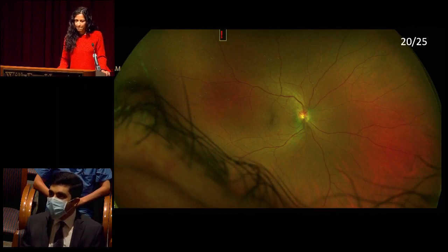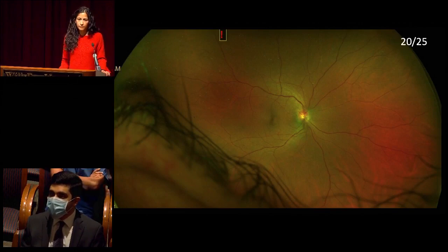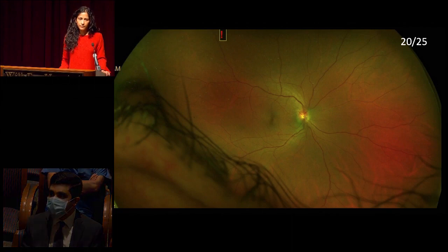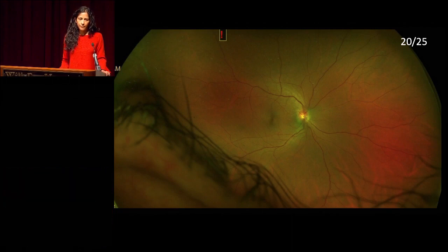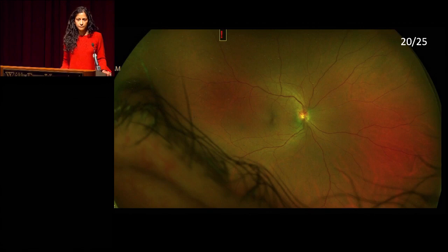Here we have a wide-field pseudocolor image of the right eye. Vision is 20-25. The media appears clear. The disc has sharp margins, no edema, and a relatively normal cup-to-disc ratio. The vasculature appears normal in course and caliber to the visualized periphery. The macula looks unremarkable — no lesions, no hemorrhages — and the periphery also looks relatively normal.